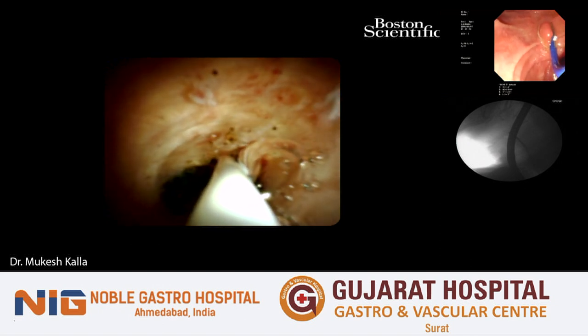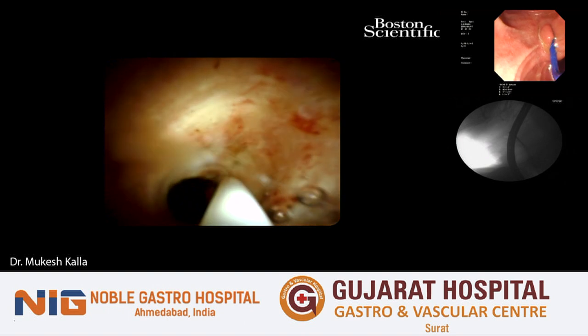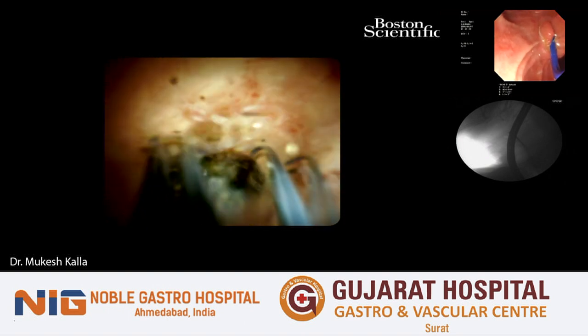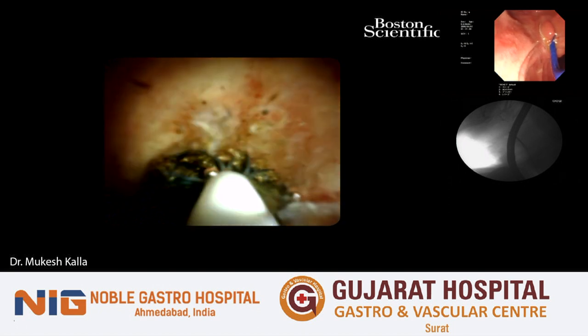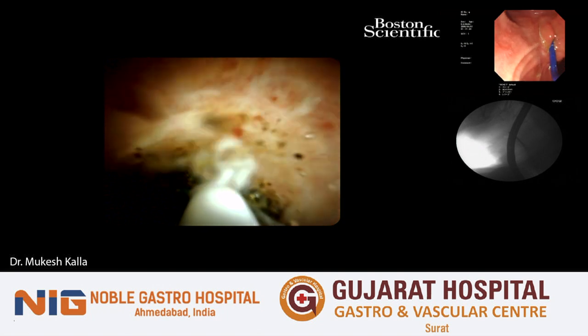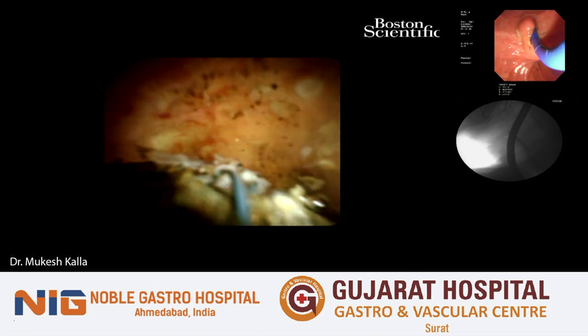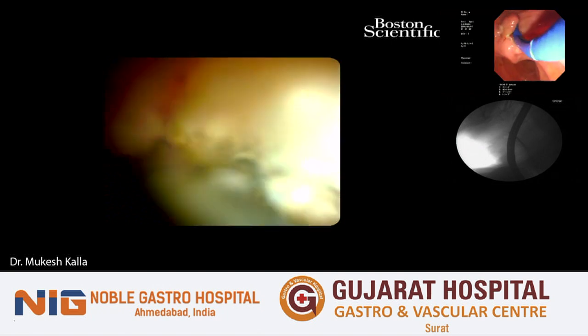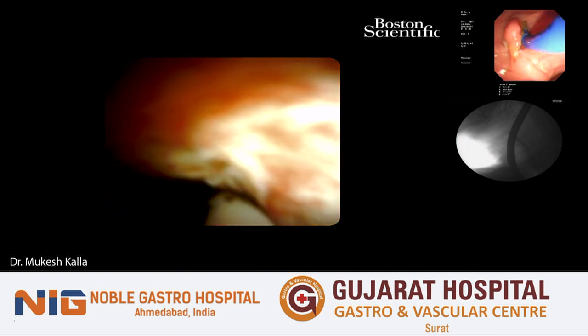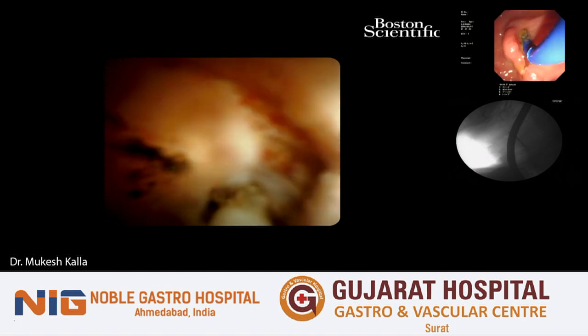Now go. Open. Now open. With a jiggling movement, I think you should get it. Catch it. Now it is. Yes. Somil has done a great job, and now I'll just bring the cholangioscope out. Just get rid of this stone first.